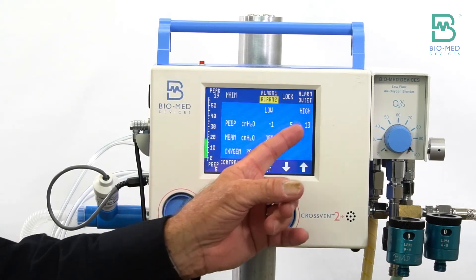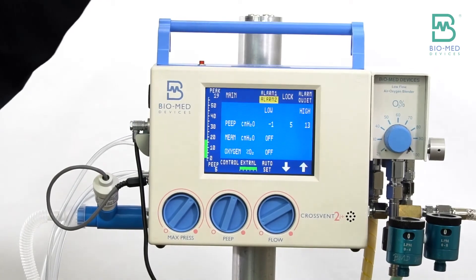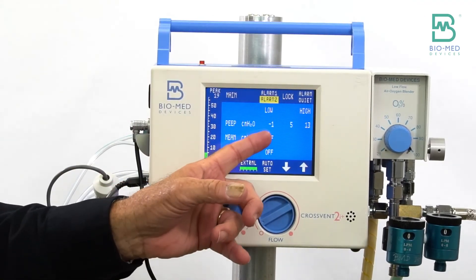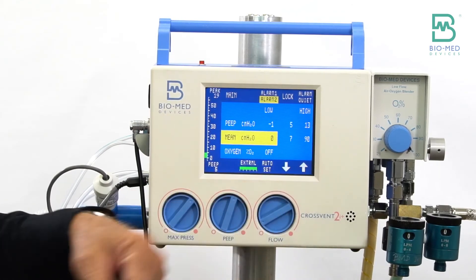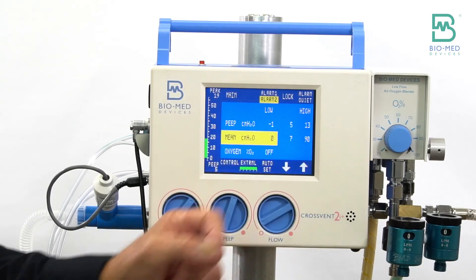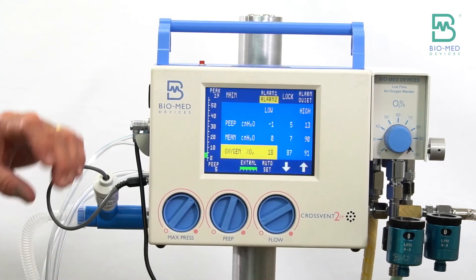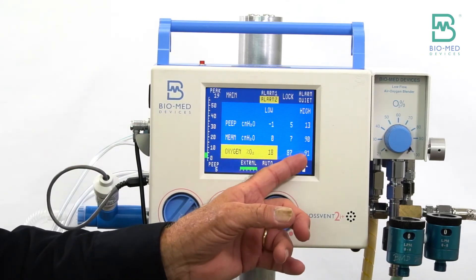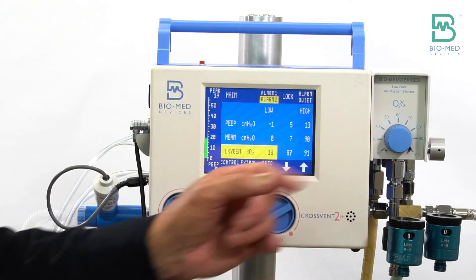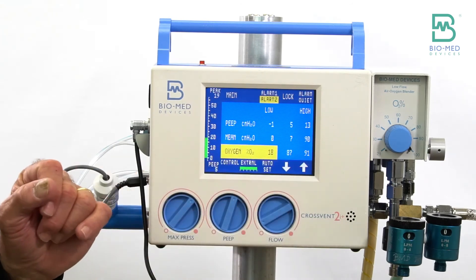On alarm screen two, you have PEEP alarms — high and low. The middle column is your current value, so it's reading five, which is a repeat of the five shown on the main screen. Mean airway pressure can be turned on with a high and low setting, and this displays your current mean airway pressure value. And if you have the oxygen analyzer connected, you can have your analyzer read out your oxygen display from your blender, with high and low alarm settings.